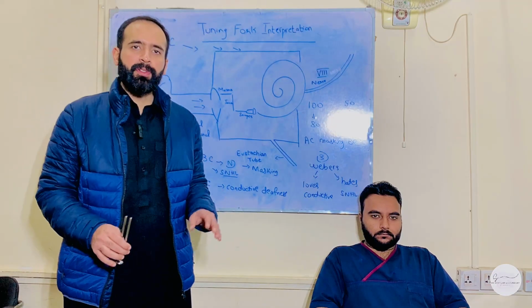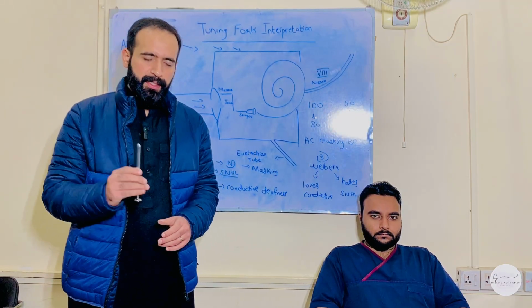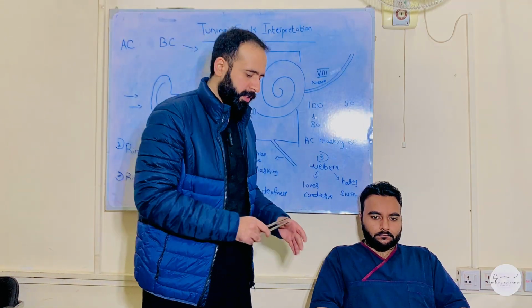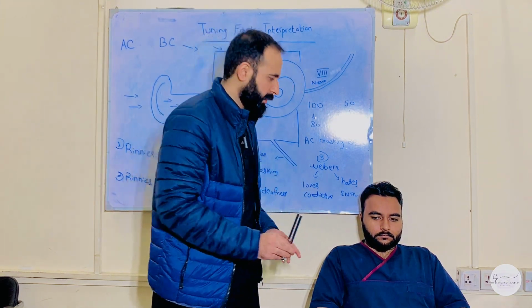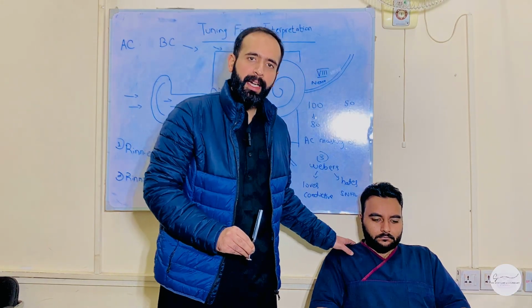There is another scenario number 6, which happens in rare cases. Let's consider that one. Let's say I am doing the tuning fork in this patient. I strike it, I hold it in the front. Patients say they cannot hear well at the front. I put it at the back. Patients say they can hear well at the back.